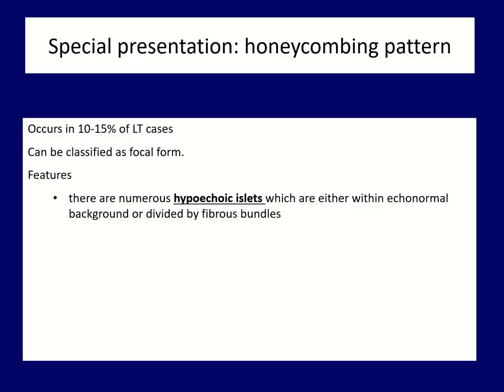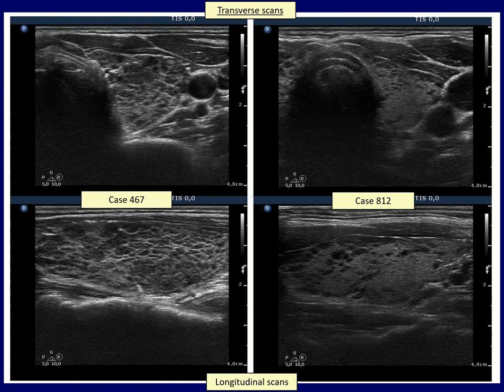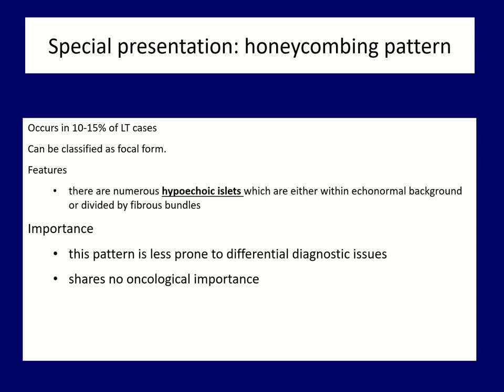The first of the three special forms is the honeycombing presentation. This is characterized by numerous hypoechoic islets separated either by connective tissue or echonormal thyroid from each other. The left case is pathognomonic. Although in the right case, a cystically degenerated thyroid lobe seems a condition to consider, thorough analysis reveals that these are deeply hypoechoic and not cystic areas. The honeycombing form has no difficulty in recognizing or separating from a nodule, and there is no concern about malignancy.